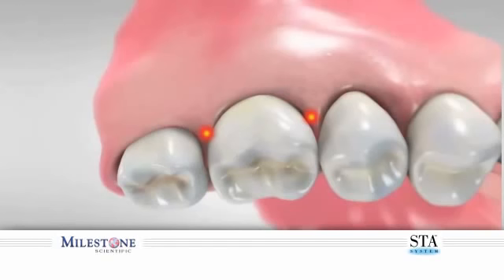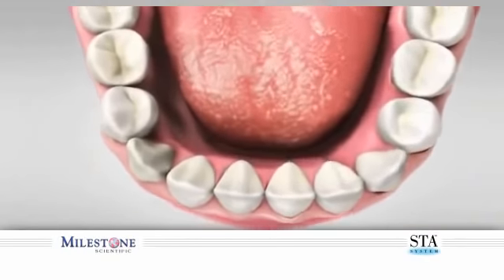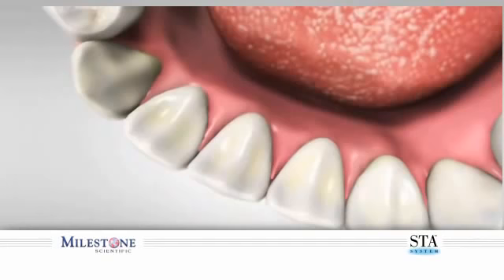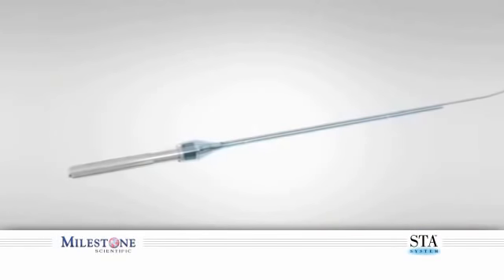When performing an STA intraligamentary injection on a single rooted tooth, it is necessary to use only a single site when performing this injection. You may choose to inject into multiple sites on a premolar or anterior teeth, as this is optional. It is important to have direct vision of the needle as it enters into the gingival sulcus.